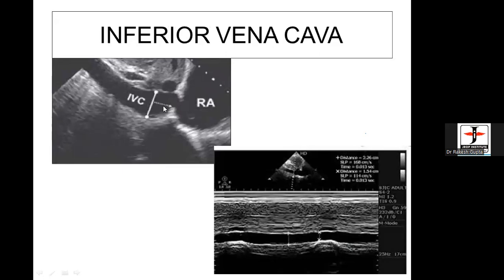Here is a hepatic vein. Can you show a dilated hepatic vein? Yes, it's here. Distal to the hepatic vein is the point where you should measure the IVC. That means the proximal-most hepatic vein, because the hepatic veins drain at different levels in the IVC. Proximal would be closer to the RA. Correct, the first one. Thank you.